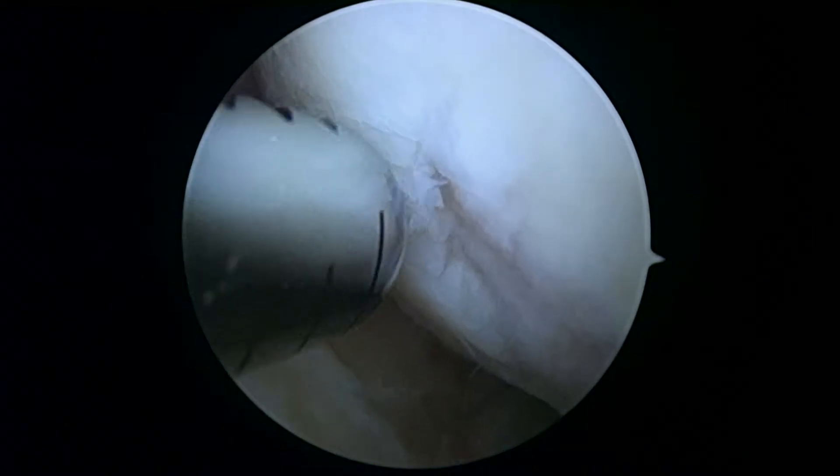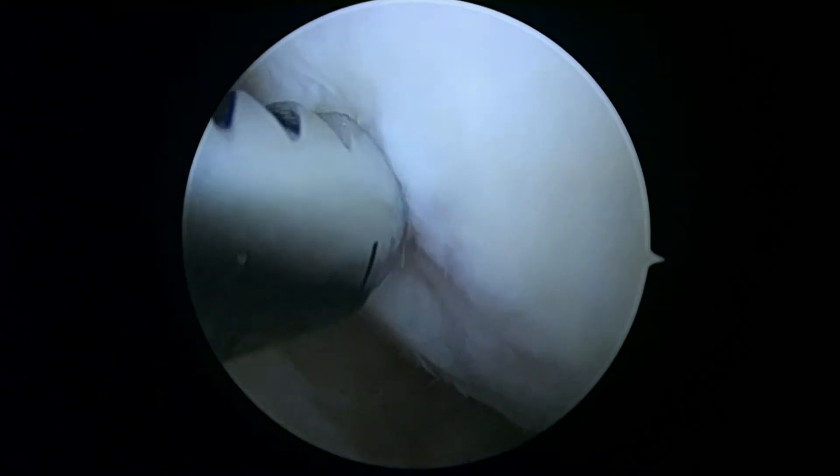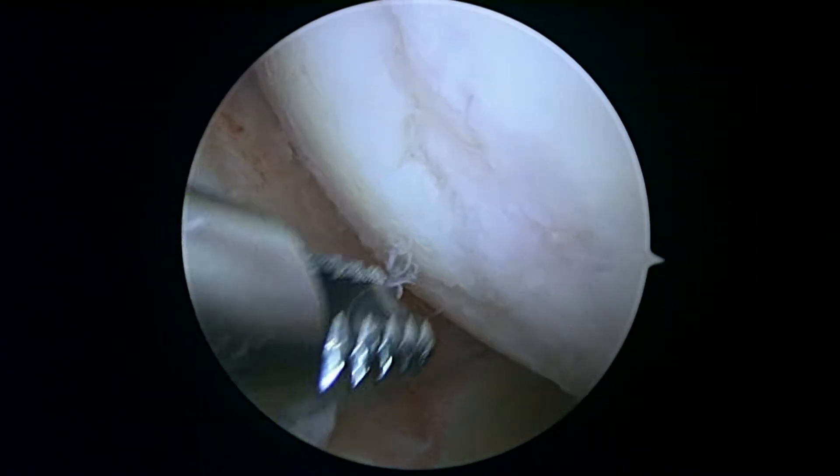That looks pretty stable there, at least at the margin. And like I said, the less I do to that, the better.